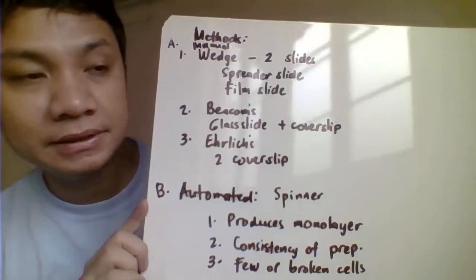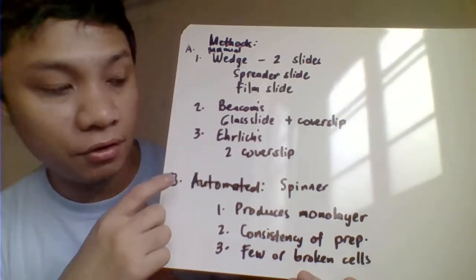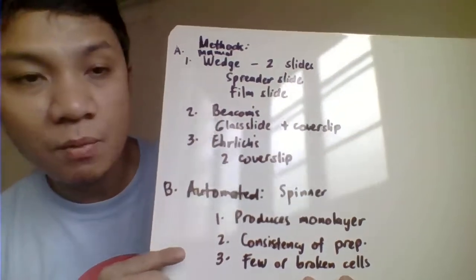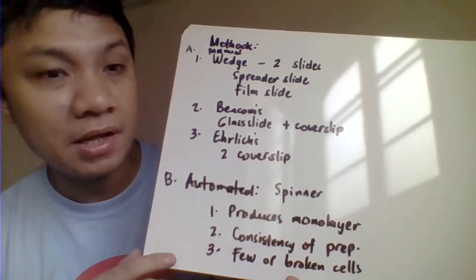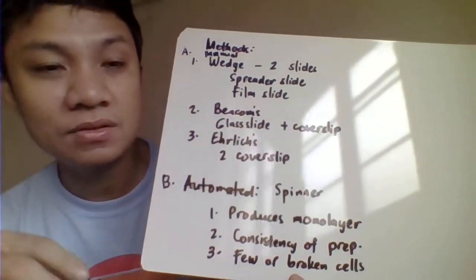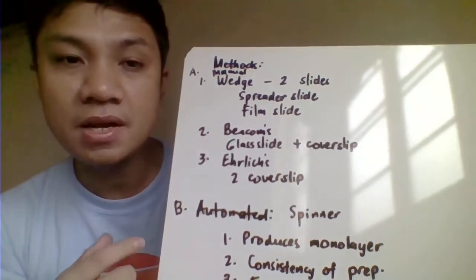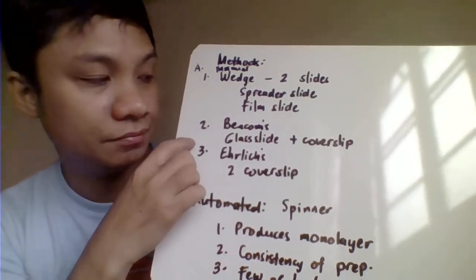Okay, so we have several methods for your blood smear preparation. You could have the manual method or you could also have the automated. We have the wedge. Wedge here is with the use of two slides. One is your spreader slide. Another one is your film slide. So the spreader slide is your pusher slide. So that's used to push or to spread your drop of blood in order for you to make your blood film. And we have also your film slide, where you place the drop of blood, it becomes your film slide.